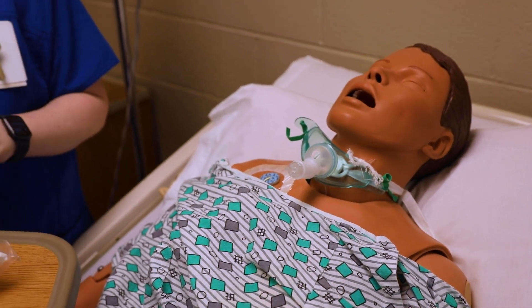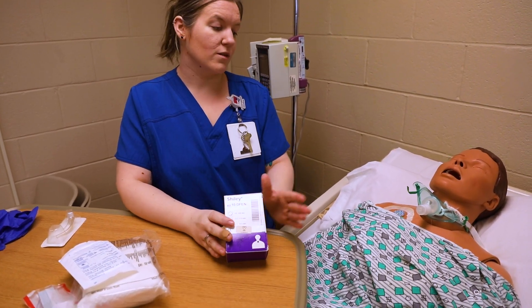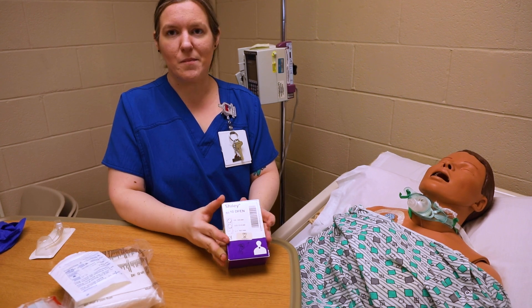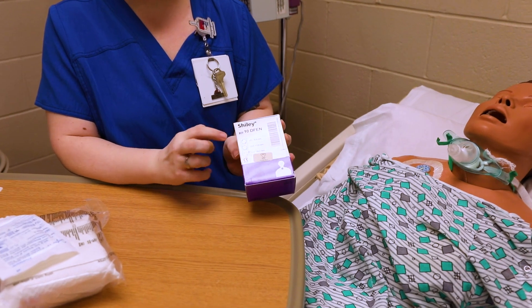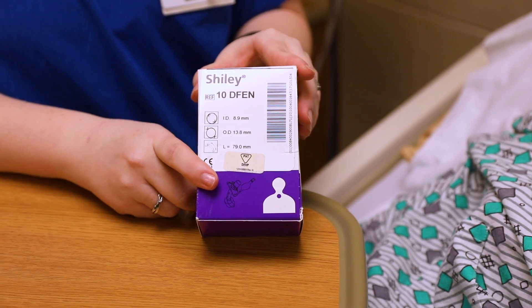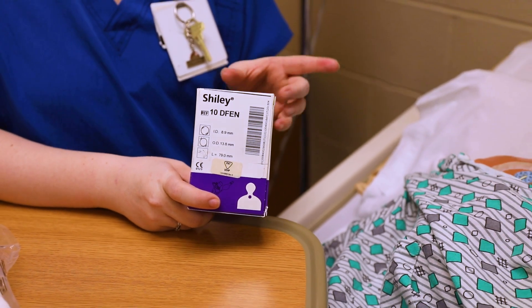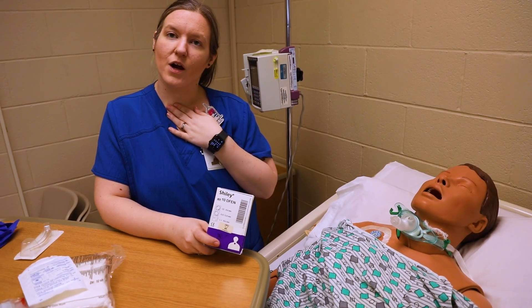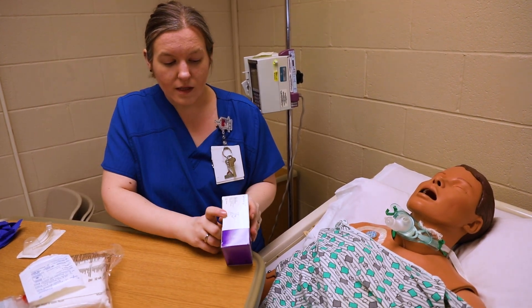Either way, you want to make sure you know the size, because the size of the trach determines what you have prepared at the bedside — regardless of whether it's disposable or not. You want to have a couple at the bedside, because should the patient pull out their trach, that could become a medical emergency. This one is a number 10. You want to have the size the patient has and then one size smaller at the bedside, because if there's swelling in the airway and it gets pulled out, you might only be able to put a smaller one in.